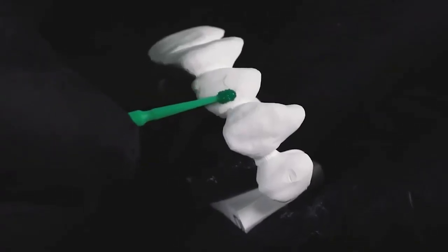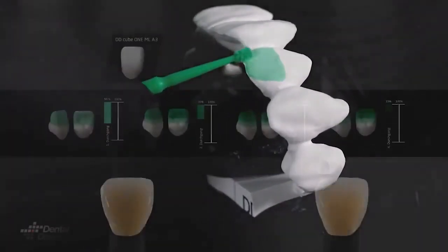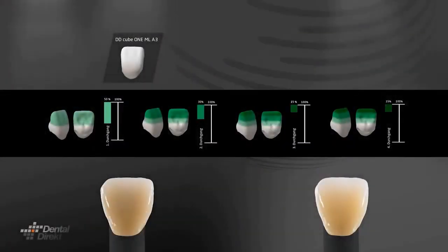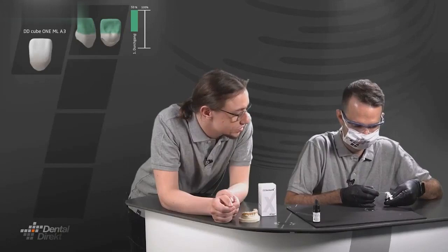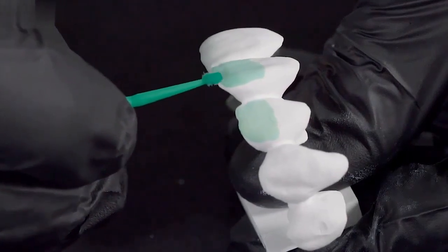Yes, Ballish, at the end we apply a total of 4 layers, and the layers are all on top of each other, so of course it's not completely congruent, it goes upwards. We are applying more and more layers, and then we can record the natural translucency progression of the tooth. Exactly, we can now see how you apply the first layer, so it's also important to always take the incisal edge with you.